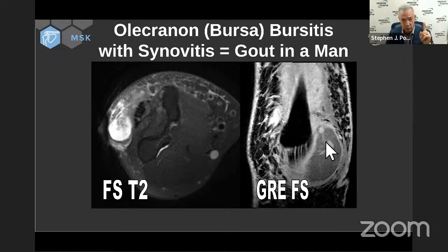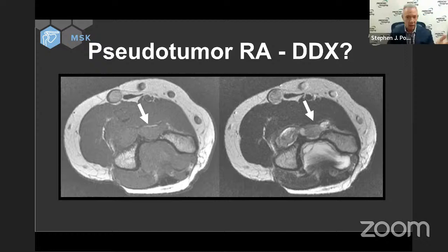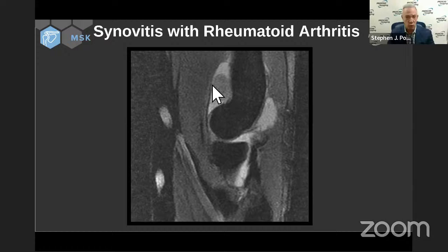Here's an example of olecranon bursitis, but no, not just any bursitis. Look inside it. It's got this funny looking heterogeneous tissue. It's in a man. The man is in his early 40s, and as stated, this is gout till proven otherwise, and it was gout. On the other hand, this is a woman in her 40s. There is distension everywhere, in the back, in the front, but there's also these large confluent areas of intermediate signal intensity. Well, I suppose they could be tophi, but with the capsule markedly distended, it is a woman. And the extent of synovitis, you have to choose rheumatoid arthritis as the first choice, and it is. There is a focal area of pannus formation in this patient with RA.